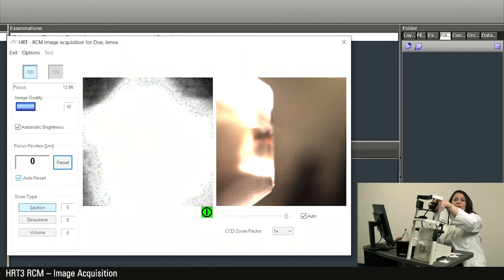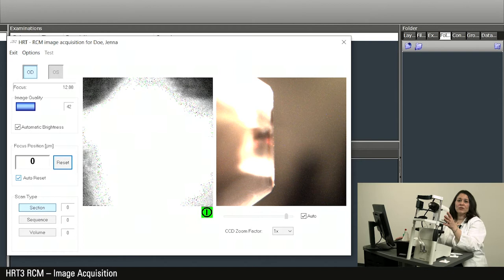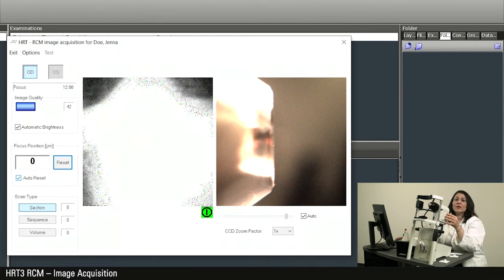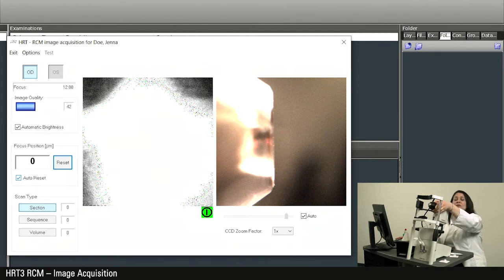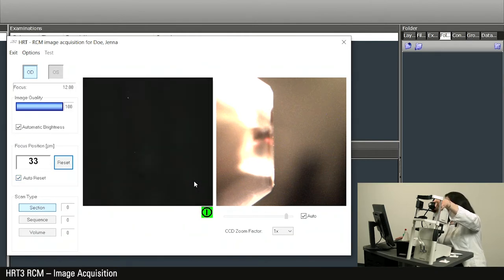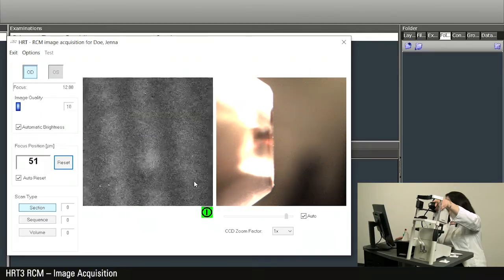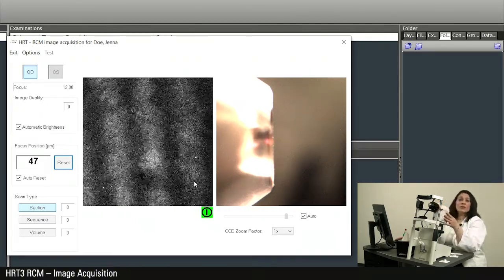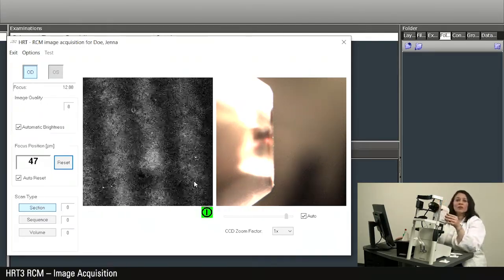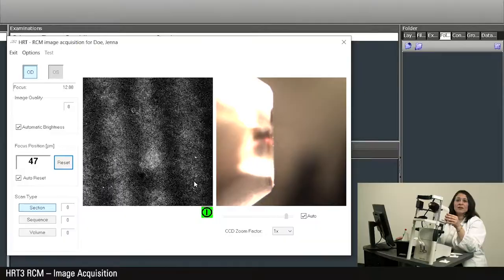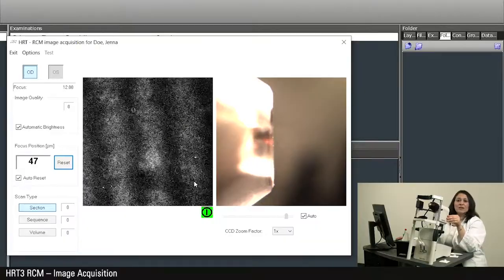The focal plane on the anterior surface of the tomo cap is now set to zero micrometers so that the depth of the examined structure can be read from this position while measuring corneal structures. To make obtaining the first image easier after docking to the cornea, I recommend setting the focus position value to plus 50 micrometers.